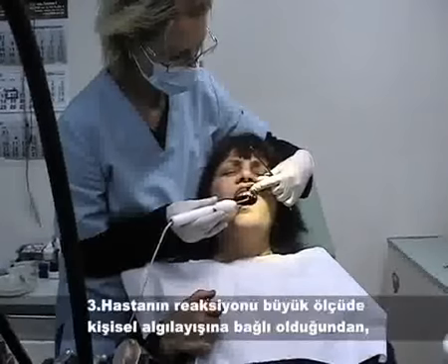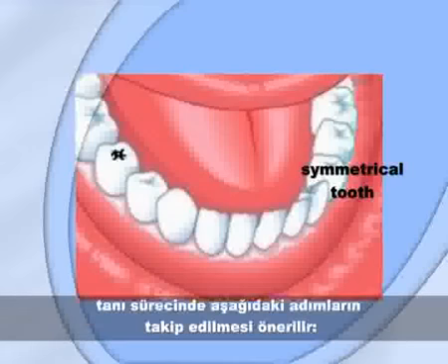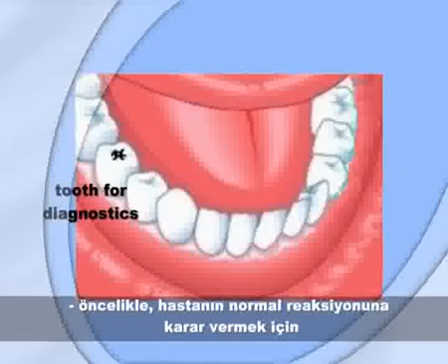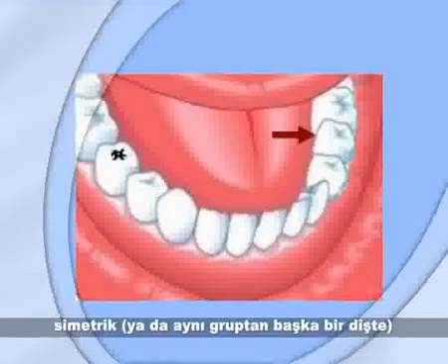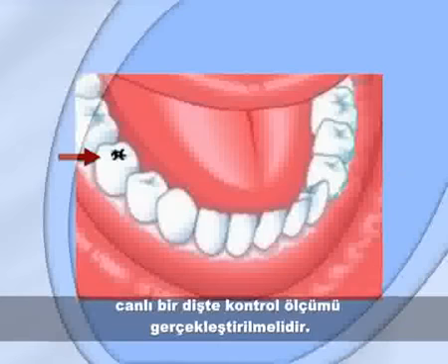As the patient's reactions depend to a great extent on their individual peculiarity, the following sequence of the diagnostic process is recommended. A control measurement of a symmetrical vital tooth or a tooth of the same group is performed first, to determine the normal reaction of the patient.